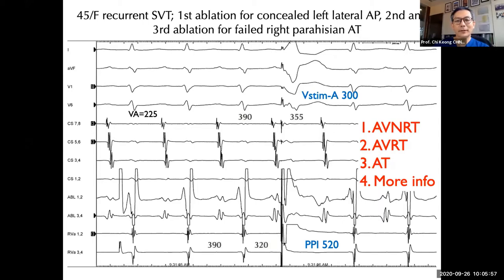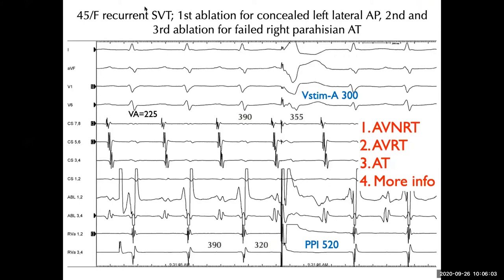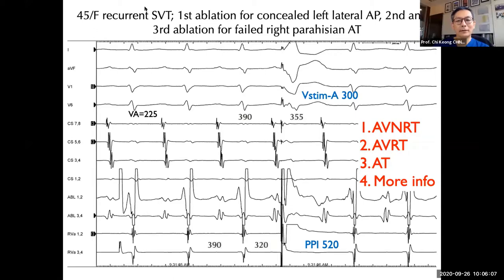Okay, so 22% think it's an AVNRT. 40% think it's an AVRT. And 15% think an ATAC. And those who choose option 4 are always correct. You know, it's always good to have more information. But all right. Okay, so for my fellow panelists, feel free to chip in.